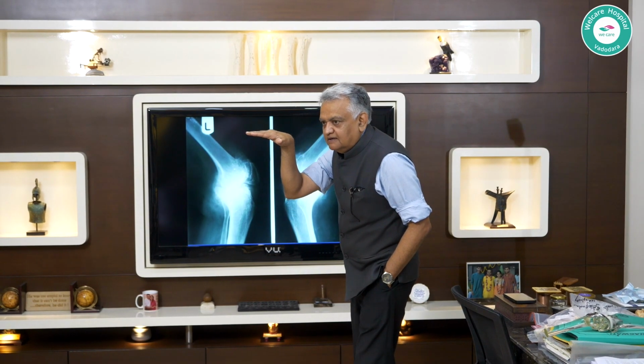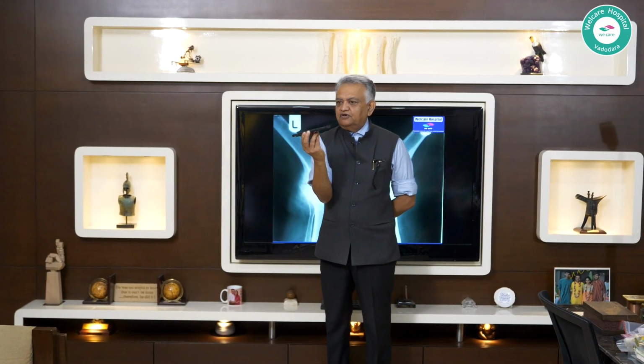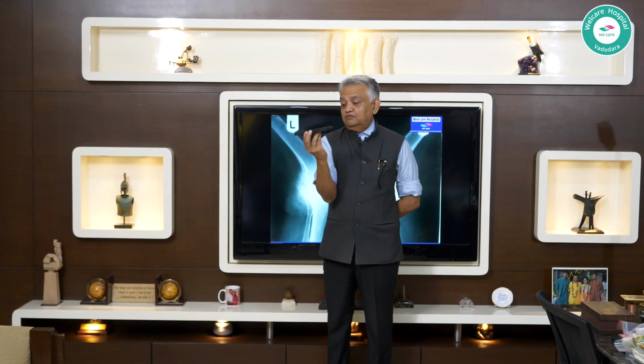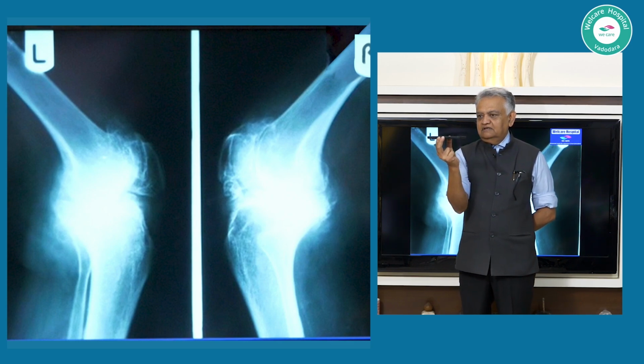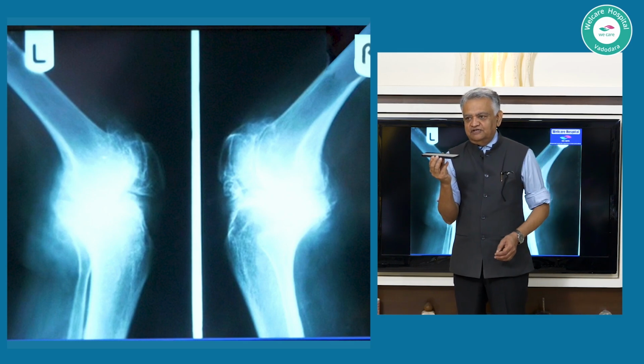When I see, for example, here, tell me, is this horizontal to the ground? Why not? I mean, you don't have a navigation. How can you be sure it is not? Common sense. Does that look horizontal to the ground now? From here? Yeah? Now, you can actually test yourself.